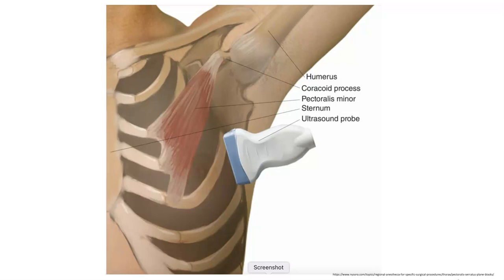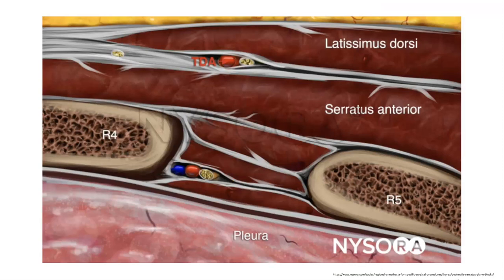Here's a photo of where we're going to be putting the ultrasound probe. We're going to put it in the mid-axillary line at about the fourth or fifth rib with the probe marker pointed up towards the patient's head. With the probe in that orientation, this is the anatomy we'll be looking at. We can see the fourth rib here, the fifth rib here, and the pleura just deep to that. Our more superficial muscular landmarks are the latissimus dorsi muscle and the serratus anterior muscle.